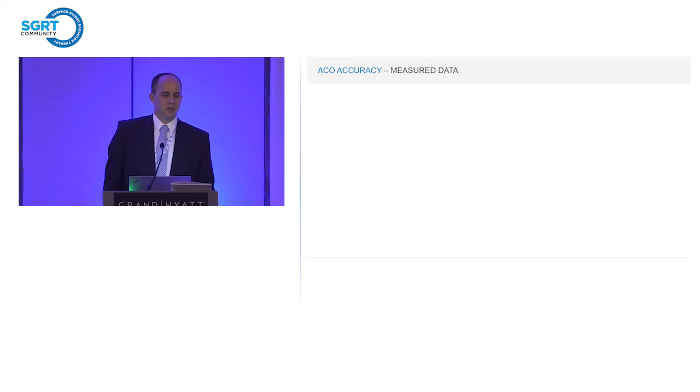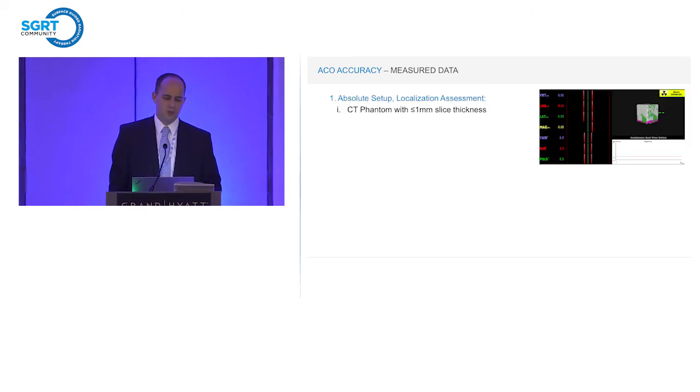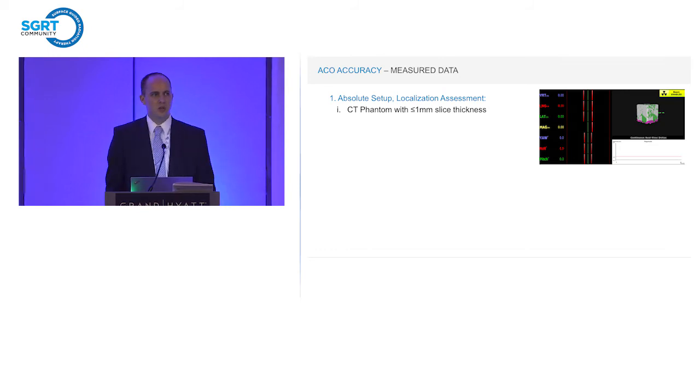So firstly, the absolute setup localization assessment. This is basically our patient treatment workflow. So we take our phantom. In this case, we use 2 different phantoms. We use the SRS cube that we use for MV IsoCal, and we use the Max HD phantom, which I know we've discussed elsewhere in this meeting. It's an anthropomorphic head phantom we can see out back.